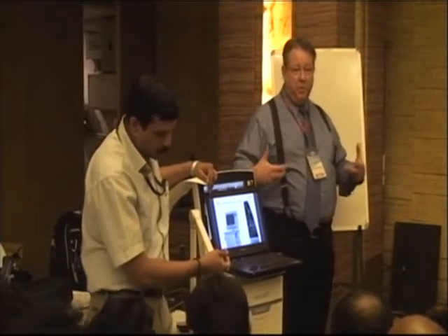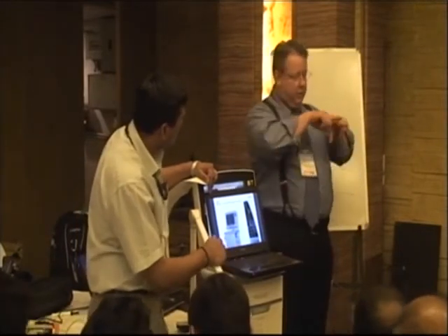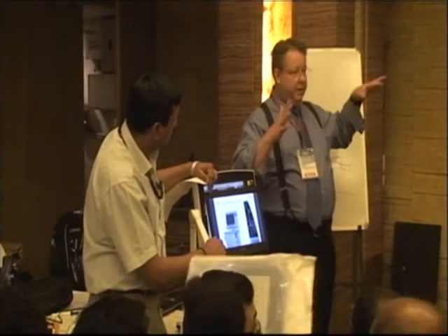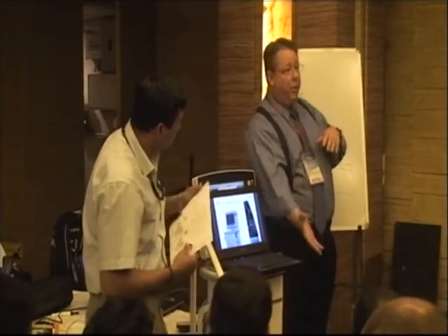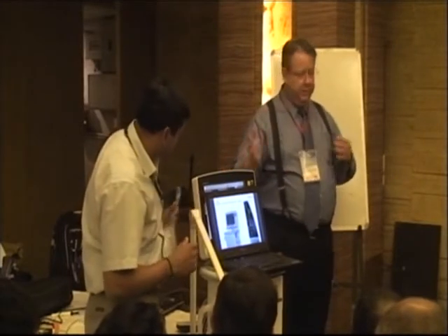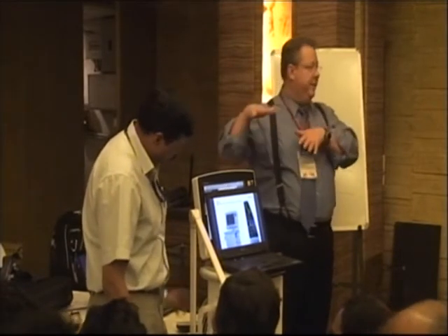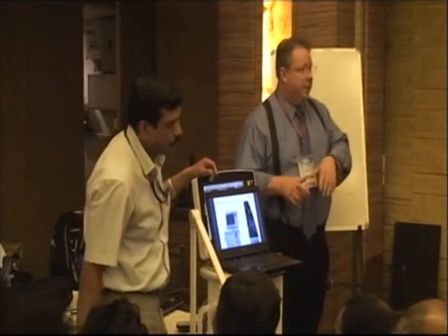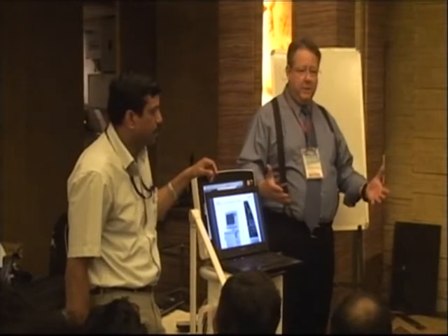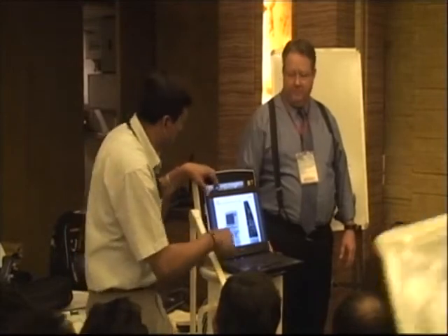So this is the mode that's going to be more comfortable. Dr. Zimmerman showed in this slide, and I have some slides I can show you as well, that patients who are trying to synchronize with standard mechanical ventilation, when all we use is pressure support, are often stacking breaths or having to abort a breath halfway through. It's not very synchronized at all. But with neurally adjusted ventilator assist, they are able to breathe as much as they want, and we give them a breath every time they trigger it, and we stop it when they stop. So you get these short breaths, but it's much more comfortable. It's really like pressure support, but it's not on a flow trigger, it's on a diaphragm trigger.